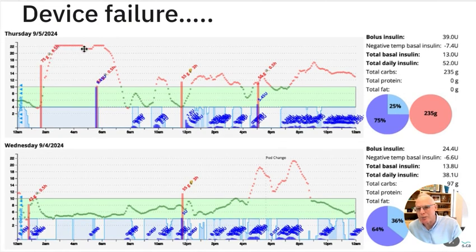but the sugar redlines, and this indicates, in the absence of a very loud Omnipod alarm, which you've probably heard. If you've heard it, you know what I'm talking about. You couldn't possibly sleep through it. It means that you've had an absorption failure, and the insulin is being pumped, but it's not going into the skin. It's not being absorbed, and this means a pod change immediately, and a manual bolus with a pen to get started.